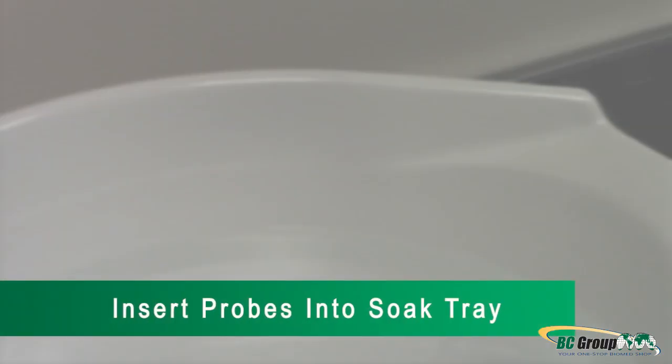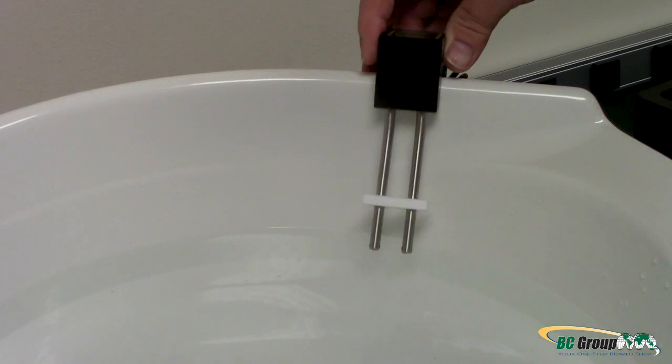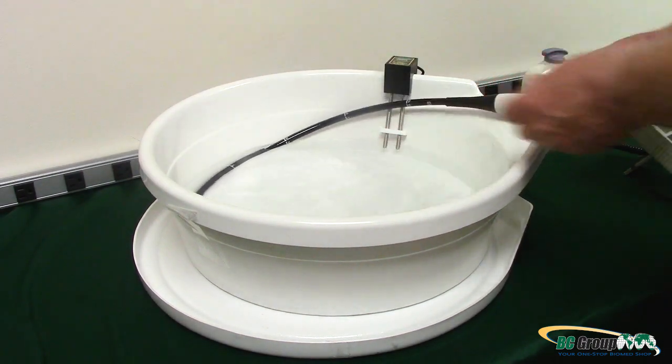Step 3: Insert probes into the soak tray. Start by placing your dual-prong conductivity probe on the edge of the soak tray. Ensure the tips are fully inserted into the cleaning solution. Next, place your ultrasound probe into the soak tray.